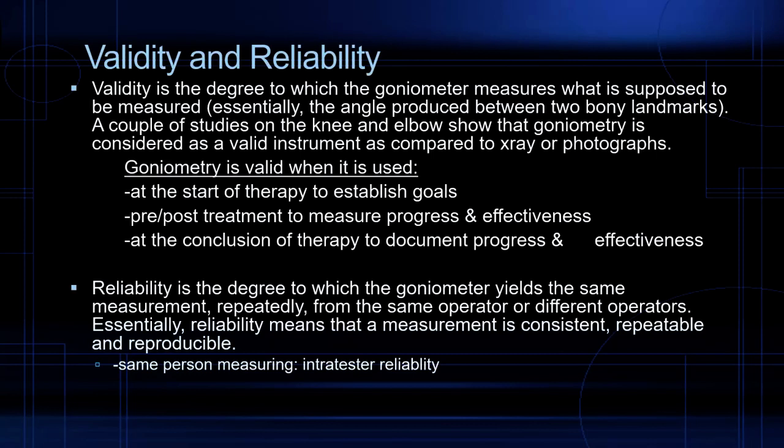So also, a little word of caution, don't Google or YouTube how to measure for your project here. You're going to only follow the example in Clarkson, and please only show that way, because I have to make sure that students know the textbook way to do it, and then you can learn if there's a clinical way that the PT that you're working for likes to measure it. Of course, you're going to measure it that way when you get out in the clinic, but for right now you are only showing and learning the Clarkson examples, okay, because that is what is valid.